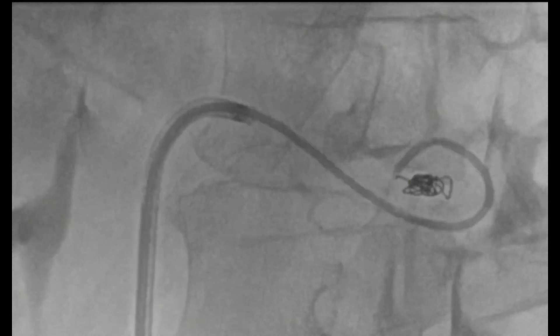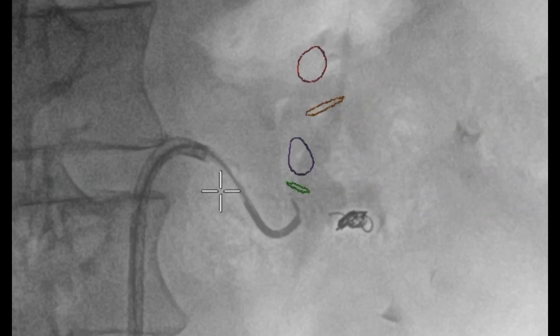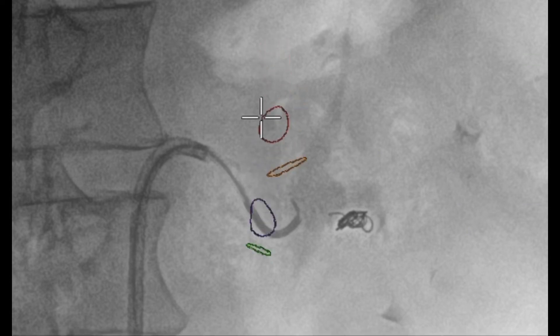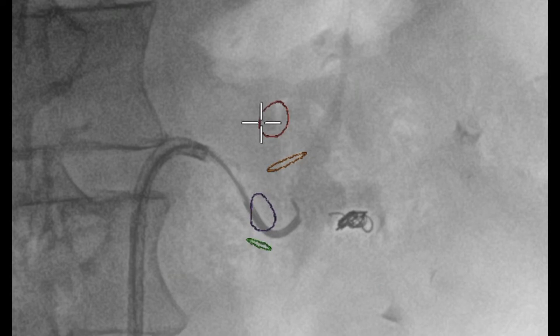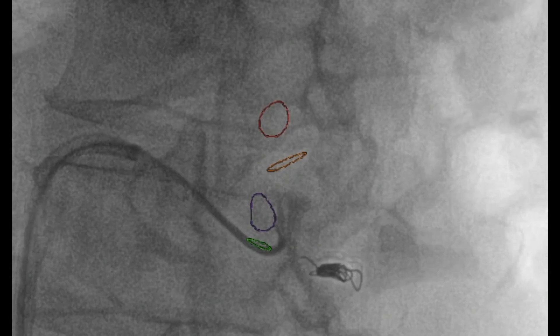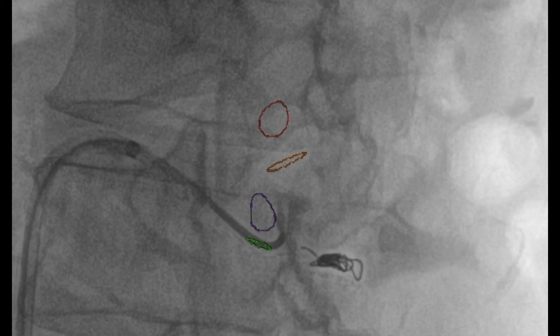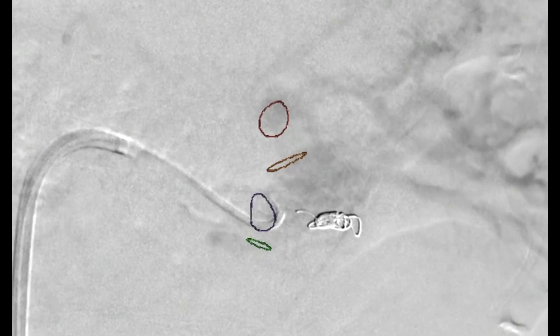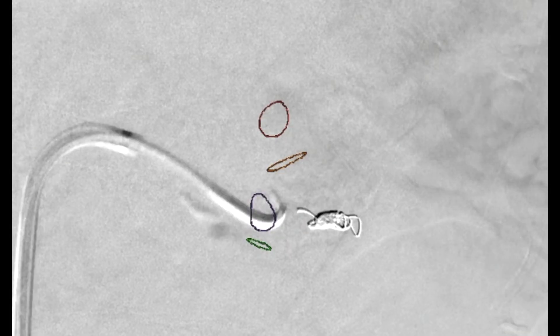Once coil embolization is performed, we then turn our attention to placing a covered stent to exclude the aneurysm sac. A catheter is then introduced in the aneurysm sac and an angiogram is performed to better delineate the anatomy.